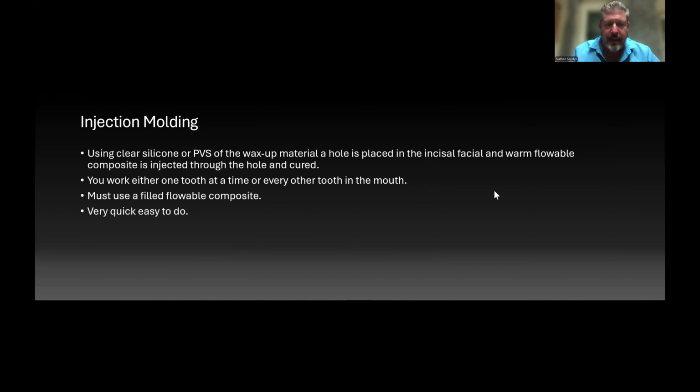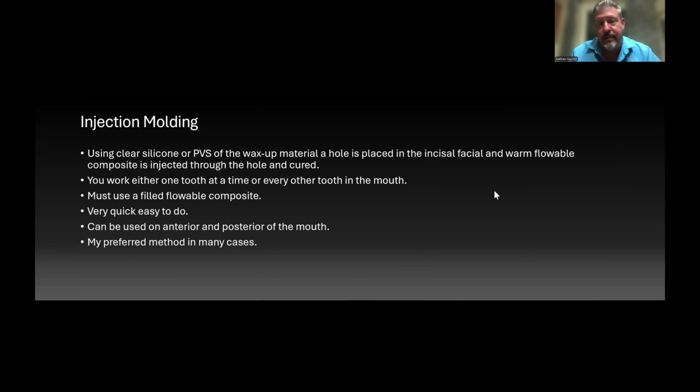I'm using that composite, very quick and easy to do. It can be used both anterior and posterior, but usually is in the anterior. This is what I use a lot.